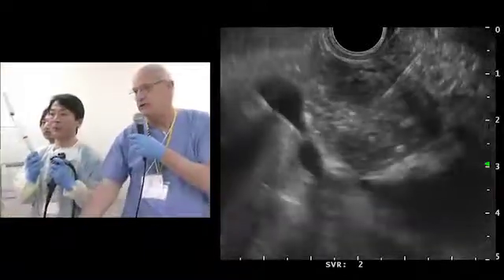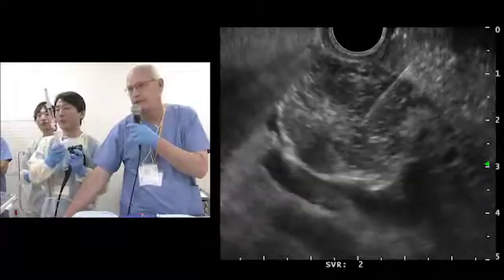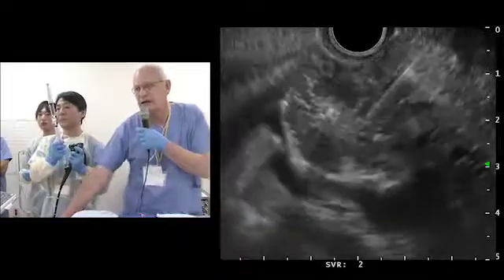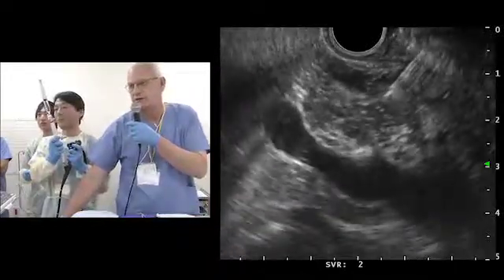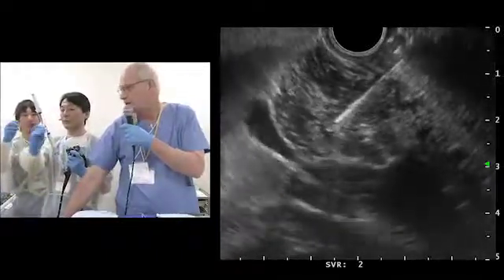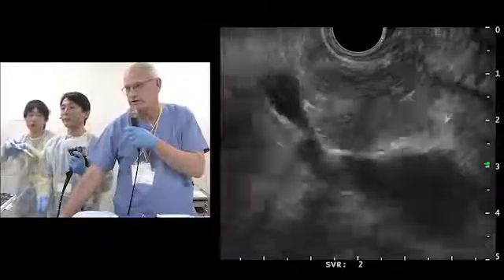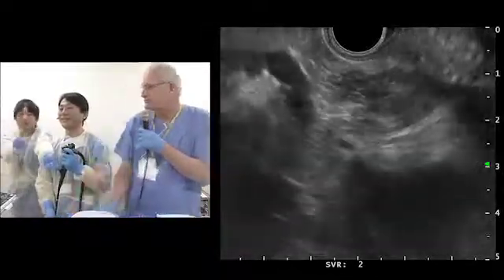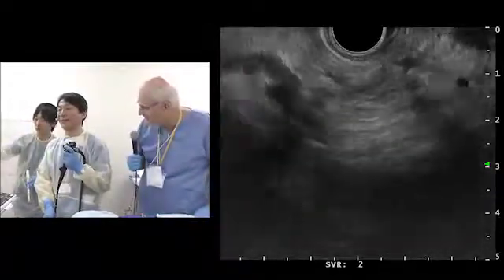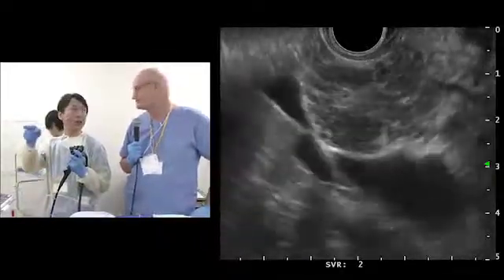We are using suction here. In my own hospital, we have had studies to show that, at least for ROSE, suctioning makes it more difficult for the cytopathologist because it produces more blood. Oh, now blood is coming. So we not only ask the cytopathologist to come in on Sunday, but we give him lots of blood. So we're not very kind to our cytopathologist today. We're sorry. Dr. Hawes, maybe the next puncture without suction?